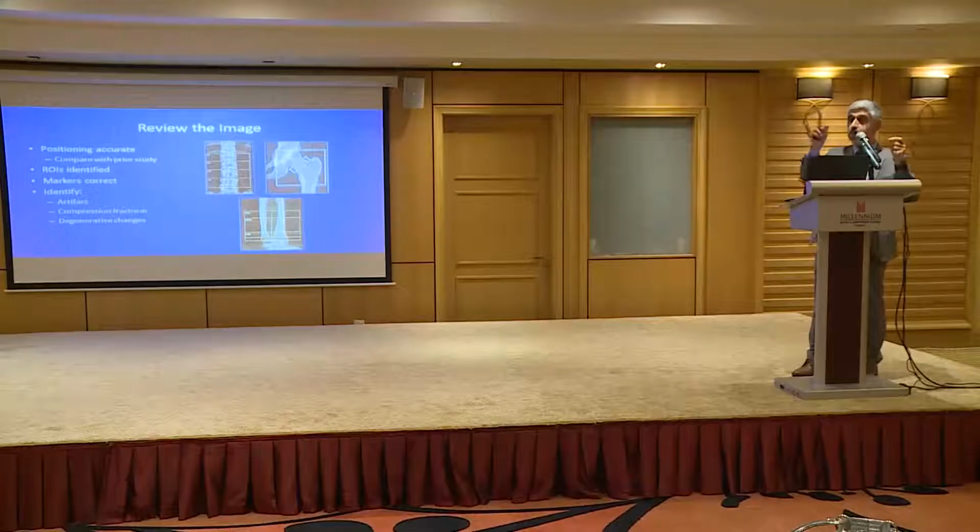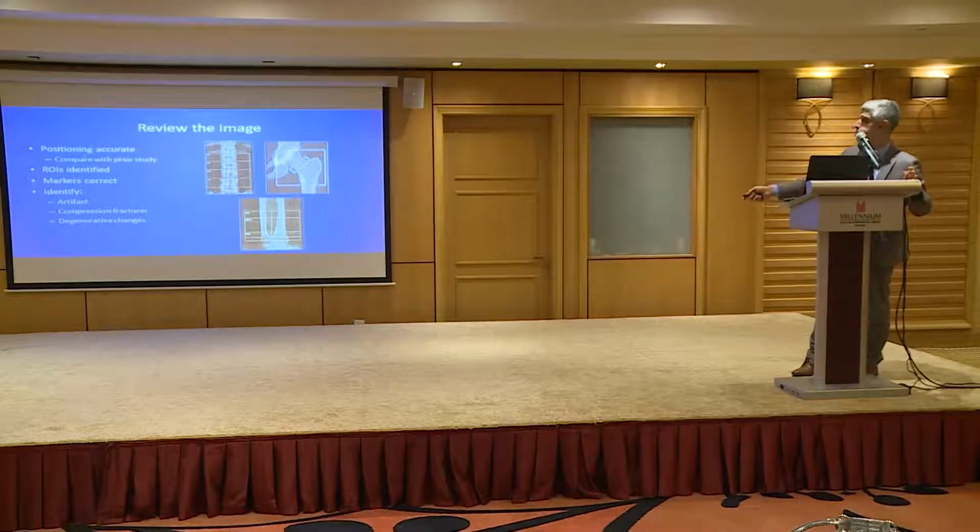So you need to make sure that your positioning is correct, as we mentioned. If you want to compare one DEXA scan to a previous DEXA scan, you also want to make sure that the regions of interest are exactly the same, because we'll show you some examples where the region of interest has changed, based on labeling being different or the space being different, which will give you different results. Regions of interest are identified correctly.